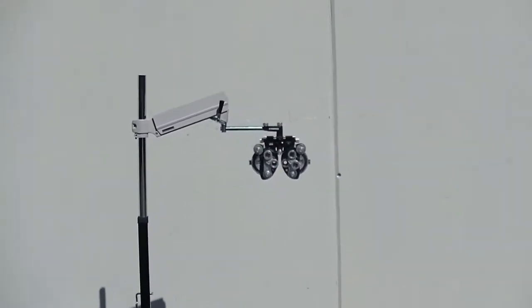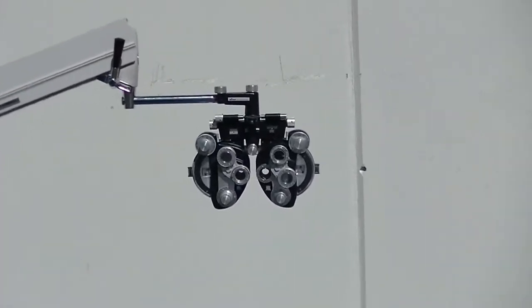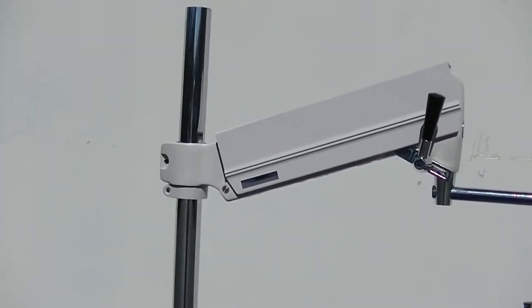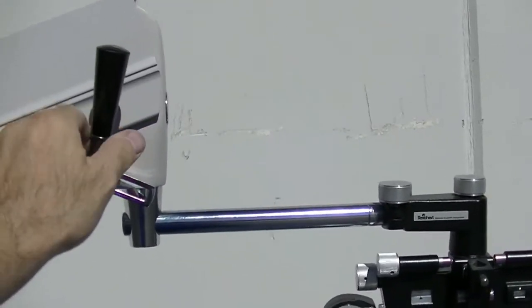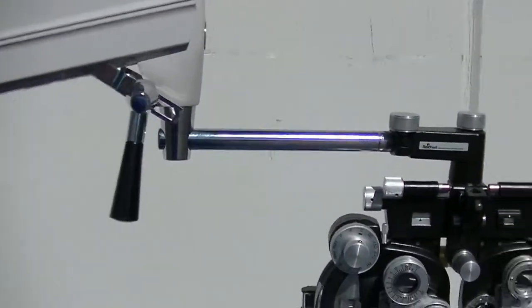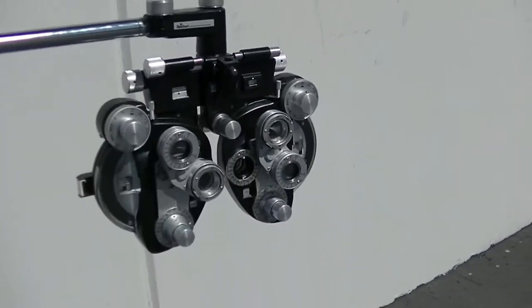As we walk up here, you'll see that we have the phoropter on the end of a standard Reliance phoropter arm. This is a regular Reliance phoropter arm that moves up and down, so you can adjust the height.